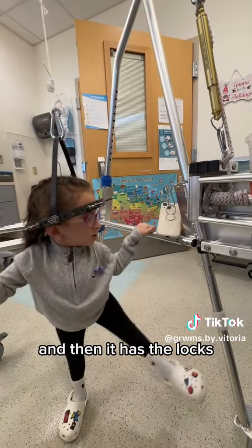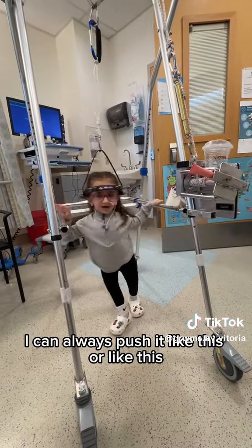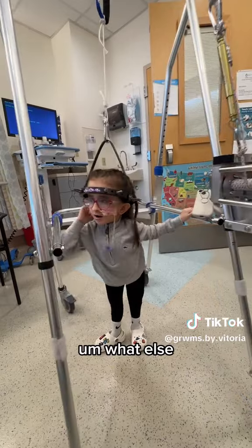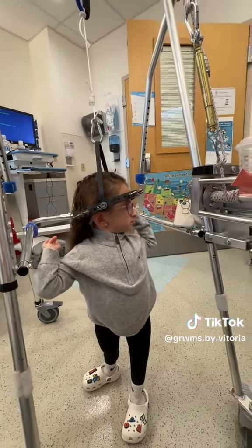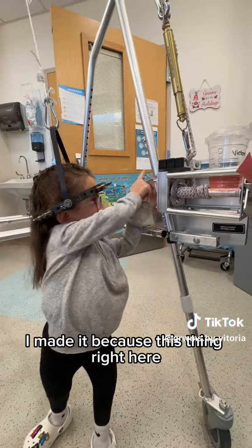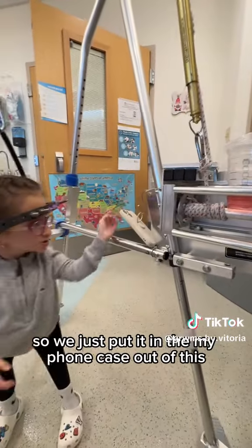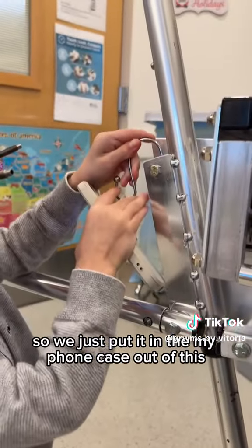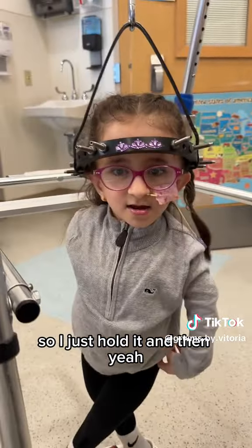It has locks — I can always push it like this or like this. It also has a phone holder that we made, because this thing on the rope right here wasn't being used, so we just put it in my phone case and held it there.